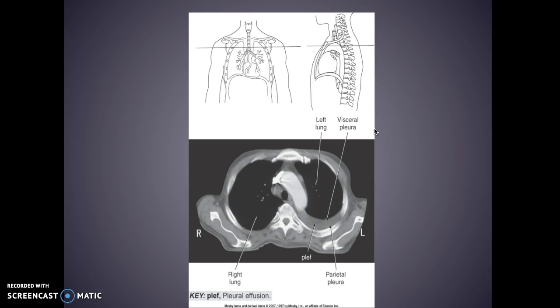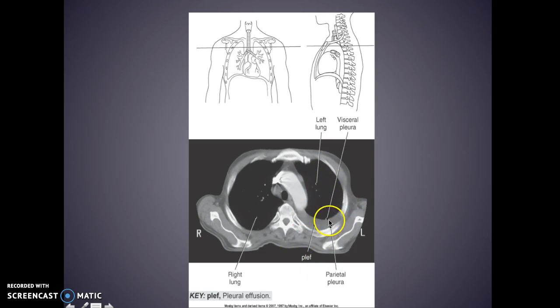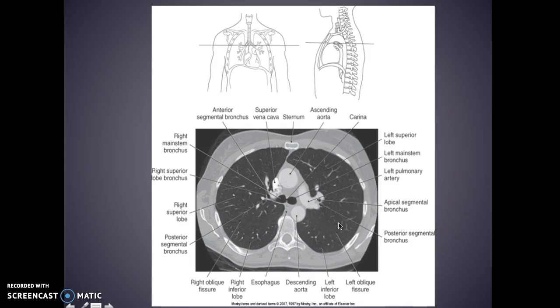This is real simple: this is your left lung, this is your visceral pleura, and then you can see your parietal pleura with the pleural effusion. Okay — sternum, this is your ascending aorta with your carina, with your right and left main stem bronchus.